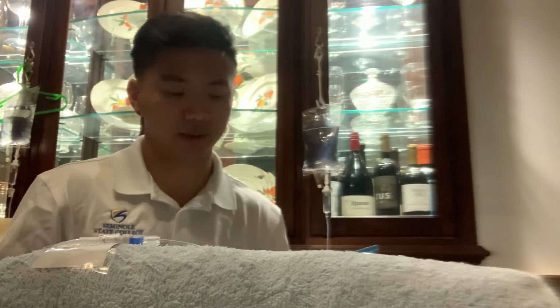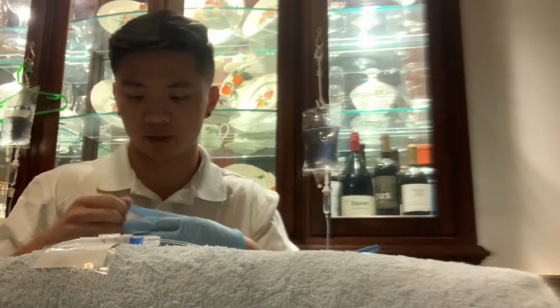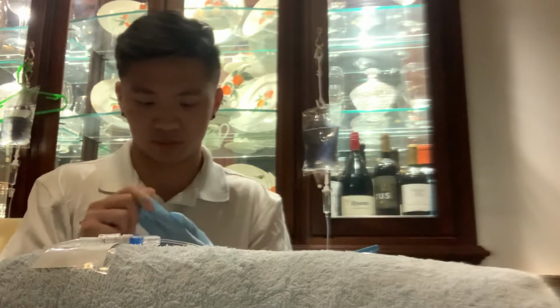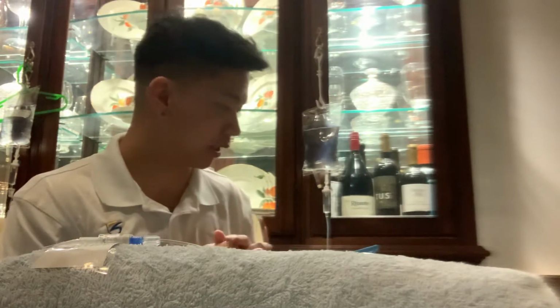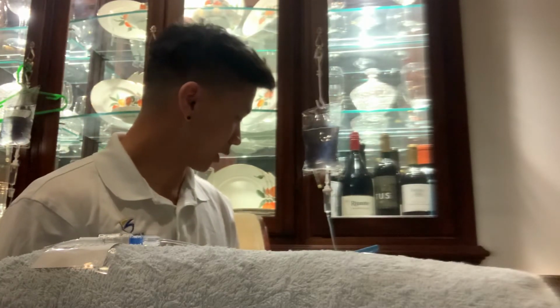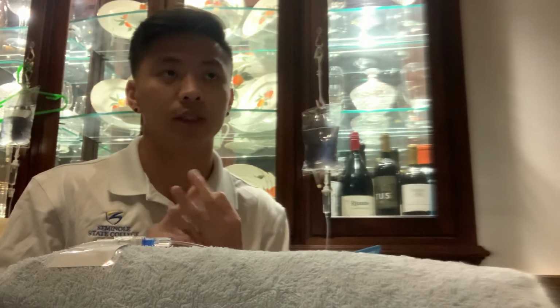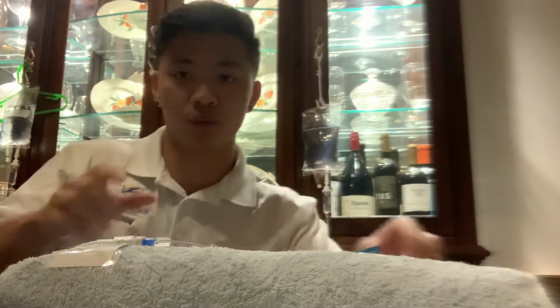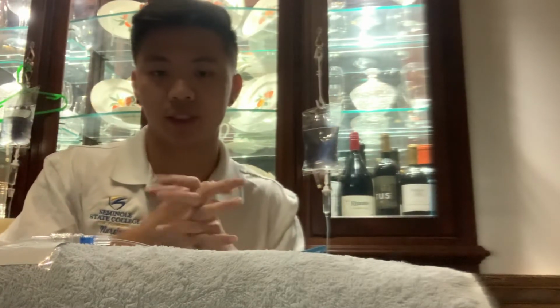After it's all finished, I would take off my gloves first. So after it's all done, I would go ahead and return to the room, close the clamp of the IV tubing, and then I would make sure to come back with alcohol pads, gloves, saline flush, and a red cap for the primary IV tubing. And then after I have that, I'm gonna go ahead and perform proper hand hygiene. So once I've done proper hand hygiene, I'm gonna go ahead and apply my gloves.